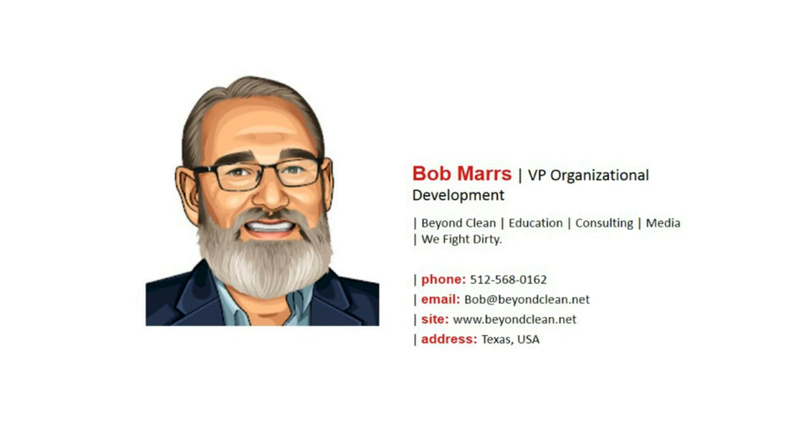Yeah, there are several hydrogen peroxide sterilizers out there. There's the V-Pro from Steris, which uses hydrogen peroxide vapor, and then there's the Sterrad line from ASP. In both cases, the sterilant gas is hydrogen peroxide.